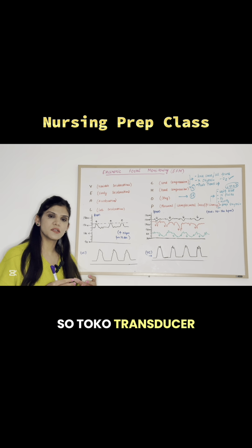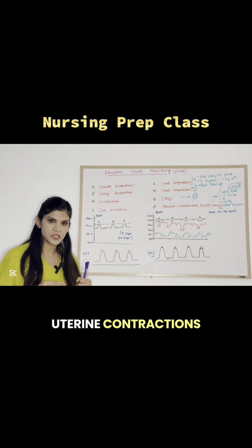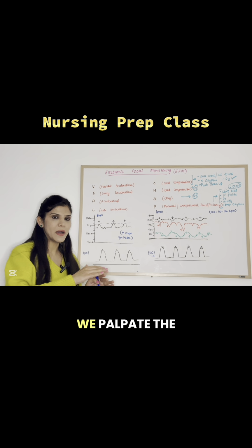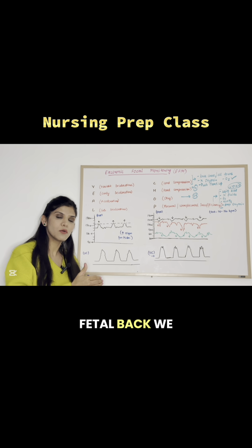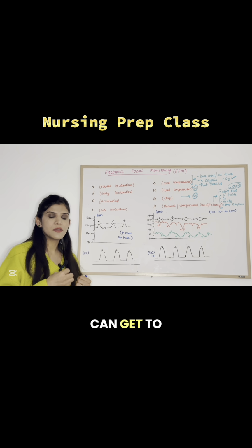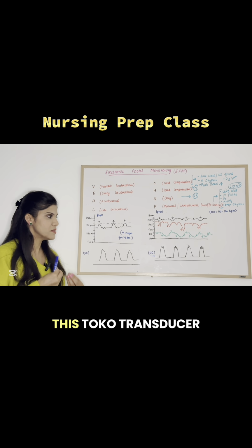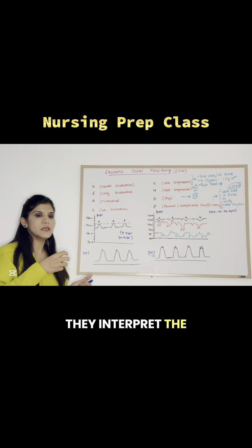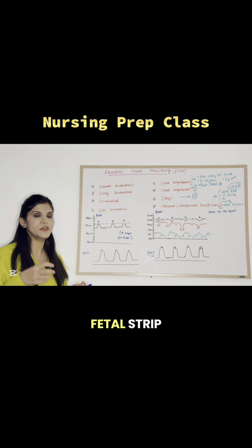The tocotransducer is applied on top of the fundus of the uterus, where it detects uterine contractions, and the ultrasound transducer is applied on the fetal back. We palpate the abdomen of the mother and locate the fetal back, and on the fetal back we place this ultrasound transducer, from where we can get to know about the baby's heart rate. These machines interpret the data in the form of a graphical representation on a strip, which we call the fetal strip.